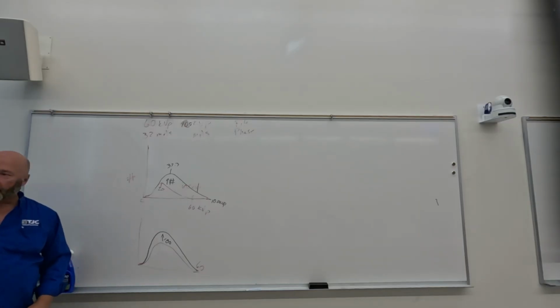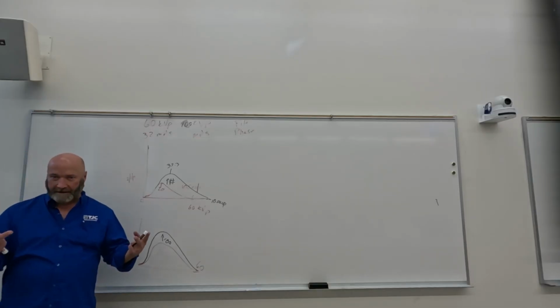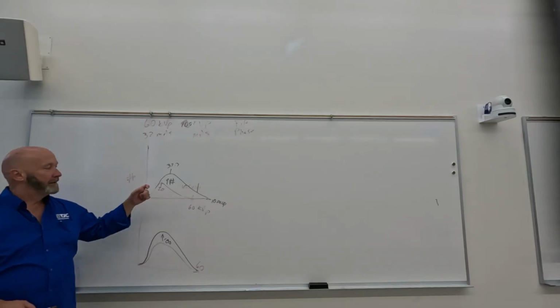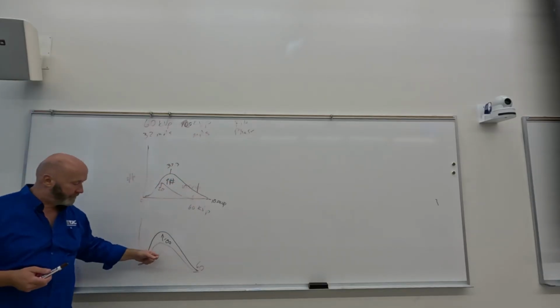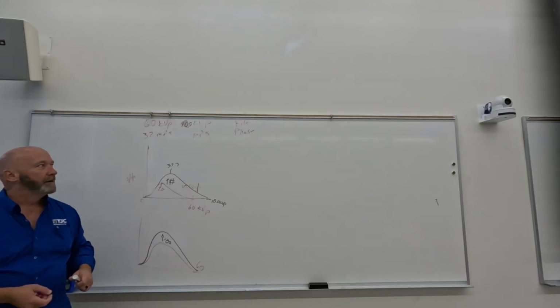If you have 1 mAs and change to 2 mAs, you have twice as many. You have 2 mAs, and change to 4 mAs, you have, again, twice as many. So it's a direct relationship all the way across the board. With kVp, increase and increase, but the increase is exponential. With mAs, increase and increase, but it's direct.